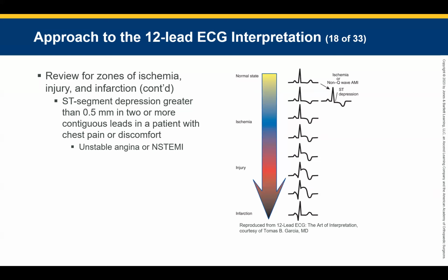You can have a small Q wave without any real injury, no big deal. But if you get that Q wave developing deeper over time, that typically means previous injury, previous infarction, I should say. What lead did this be? It's probably like lead 2, lead 3. So that's how you would check past. It can be an indicator. I wouldn't say it's foolproof, right?